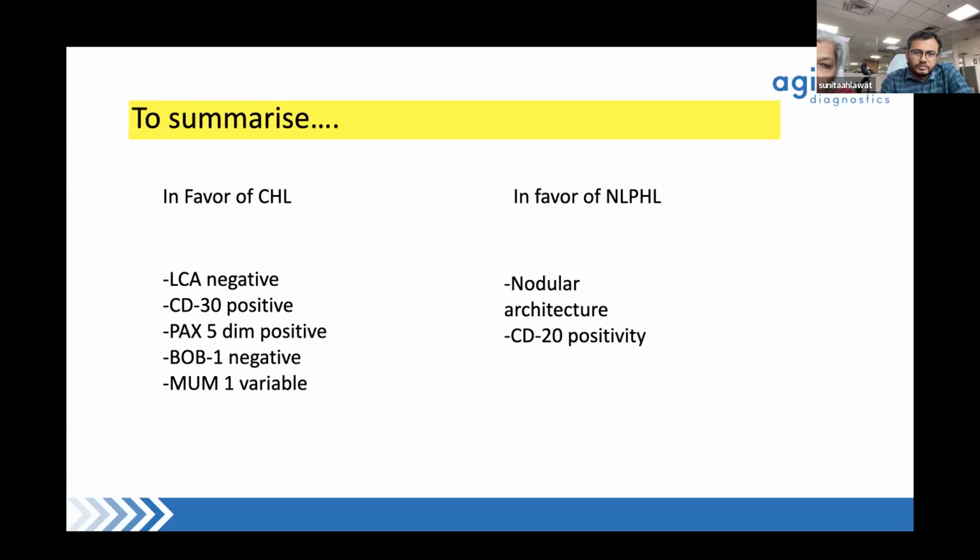Then I actually sent this case for EBER, and to Kunal to have his opinion. Because this would have resulted in so much controversy, and the parents were also not ready to accept that he has a much worse disease than NLPHL, I thought a second opinion was required for our own safety. And so we both gave the same diagnosis, that is CD20 positive CHL.